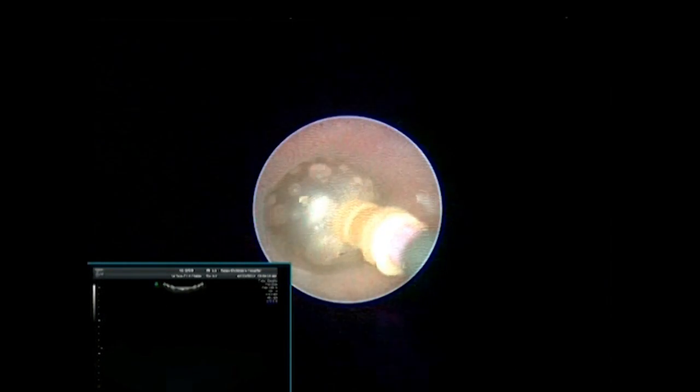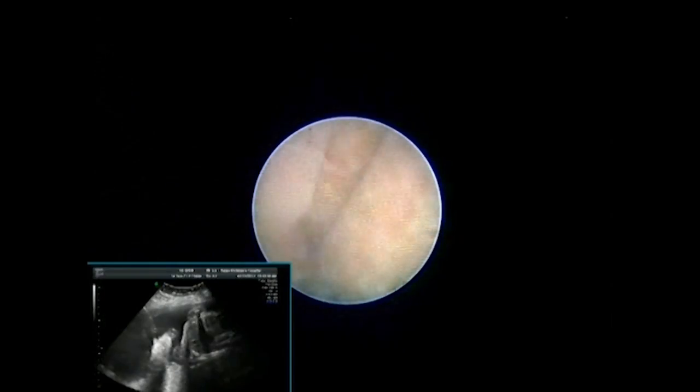And what that balloon is going to do is block the exit of fluid that the lungs make during fetal development. And the fluid will be blocked up like a dam, and as a result of that damming effect, the lungs will gradually inflate and will induce growth, and provides an opportunity for these lungs, which are very small right now, to get bigger. And the hope is then when the baby is born that they'll be able to have better lung function than they would have had without the treatment. This is the first stage of the procedure.